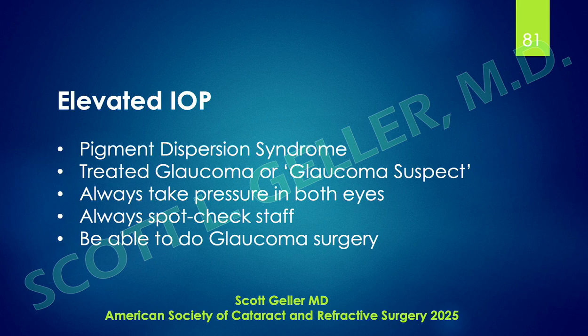In any case, there was a secondary thing that went on with this patient that was not recognized by the doctor. The staff was using a Tono-Pen to measure his intraocular pressure. The patient went in with his normal pressure.